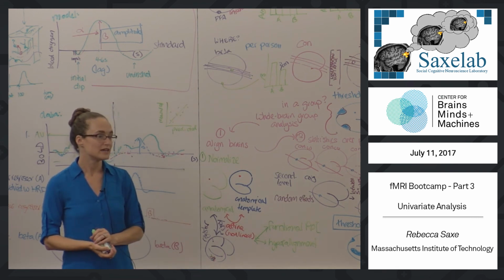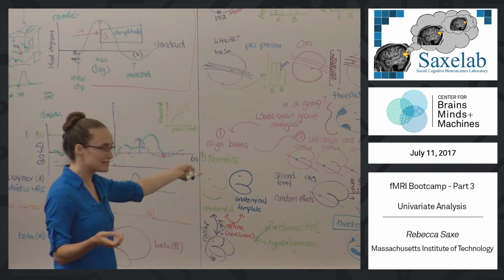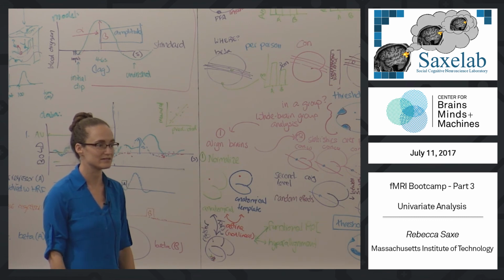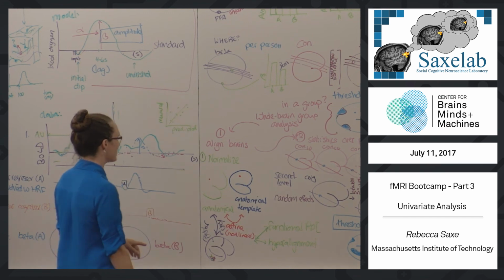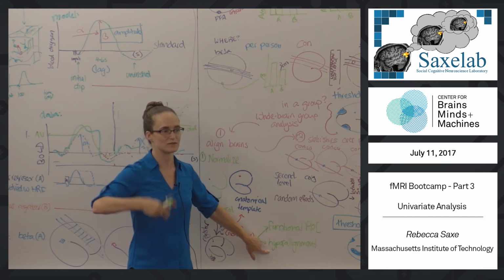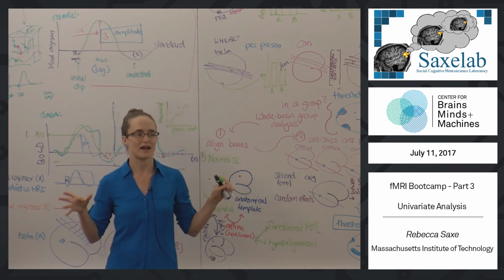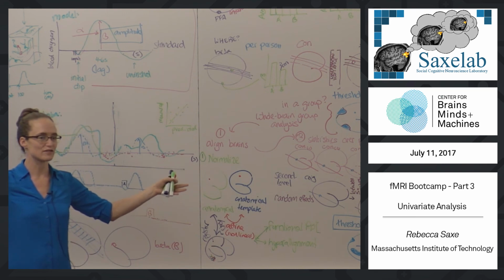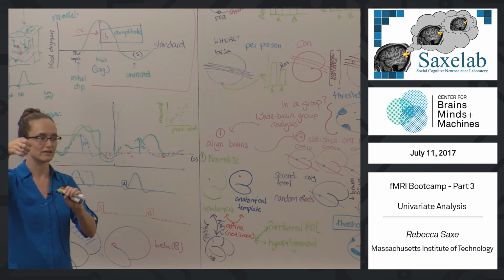And you could have as many regions as you want. For example, if you used resting state parcellations to get 280 regions, then you'd basically have a random effects analysis in the space of 280 regions. And hyperalignment is exactly the same intuition, but continuous, not binary, for anyone who cares. In ROIs, you do this by declaring regions by a binary condition: they respond to A greater than B. In hyperalignment, you say the entire brain is mapped by a continuous parameter of its function, and so you fit each voxel to the most similar voxel in functional space. But it's exactly the same idea, which is you use the spatial structure of the brain as an approximate guide, and then some functional signature to get a more appropriate registration.